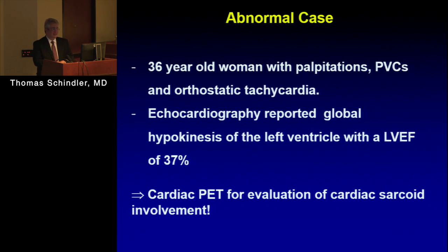So you have to keep in mind a bit the ethnic background. And that's why I'm always asking, okay, what is the ethnicity? Is it Spanish? Is it African American? Is it Caucasian? And you will see that later for the interpretation of images.